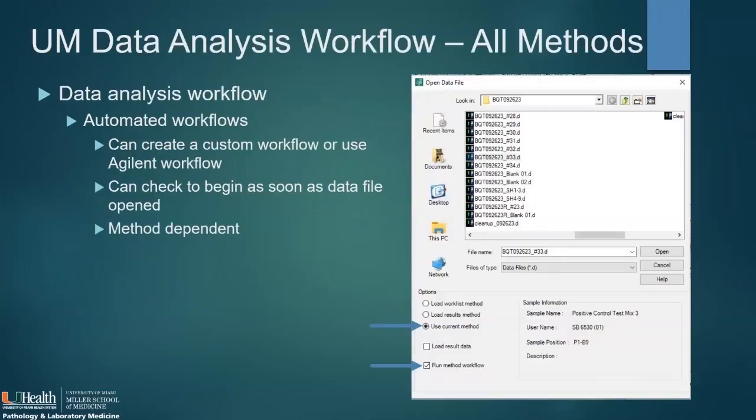So let's talk a little bit about our data analysis workflow. For all of our methods, we have set up automated workflows. You can create a custom workflow or use an Agilent out-of-the-box workflow. You also have the option to check, when loading data files, which is the screen on the right-hand side, so that the workflow begins as soon as you open a data file. And the workflow is method dependent.